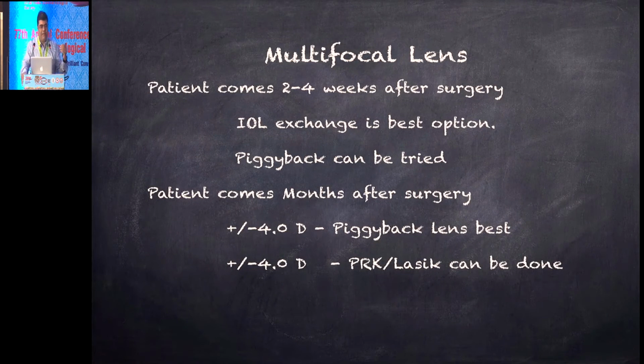Now see, if we have a multifocal lens implanted and we have a surprise, and the patient comes 2 to 4 weeks after surgery, it means this patient is either dissatisfied with some other doctor, or he is taking time, saying no, I don't want to go for exchange, or you are not comfortable with IOL exchange. So if the patient comes 2 to 4 weeks after surgery, then there are two options. IOL exchange, in my view, is the best option for these patients, or piggyback can also be tried. We have Sulcoflex lenses available for piggybacking, or you can use a 3-piece IOL for piggyback.